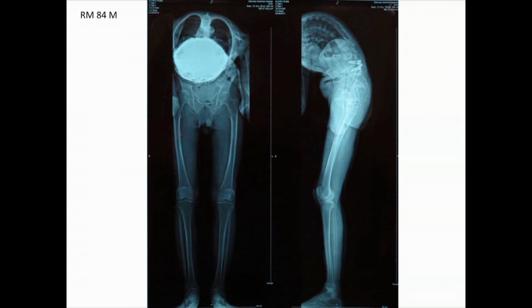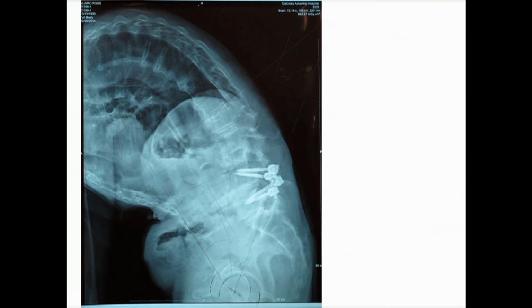And this is an X-ray called an EOS scan, an X-ray designed to look at a patient's posture and can demonstrate a patient standing in one film without the need to stitch 2 or even 3 films together. So we can see the L4-5 instrumentation, and we can see that in the sagittal plane there is a gross deformity and the patient is essentially looking down at the floor. It's surprising how your body becomes completely unstable when the weighty head is somewhere in front of you and not sitting up on your shoulders.